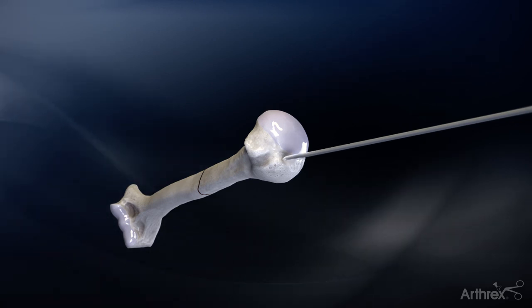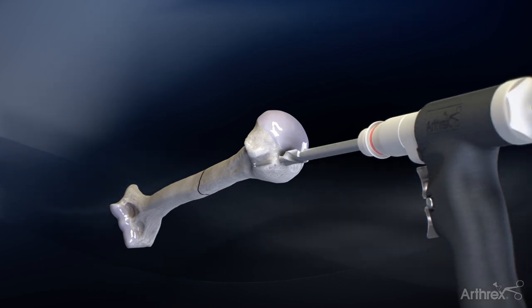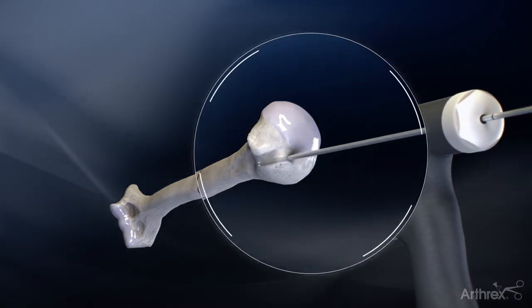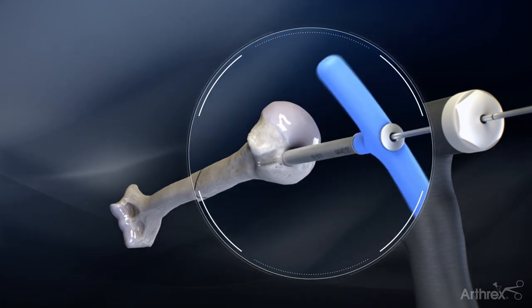Begin by advancing the 3.2mm guide pin into the desired entry point and utilize the 10.5mm entry reamer over the entry wire. The cannulated awl may also be used with gentle rotations to gain entry to the humeral canal.